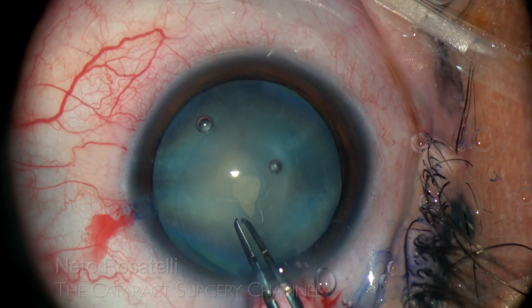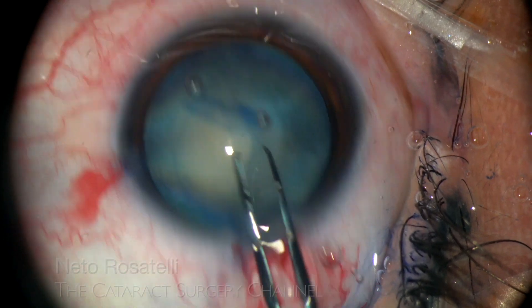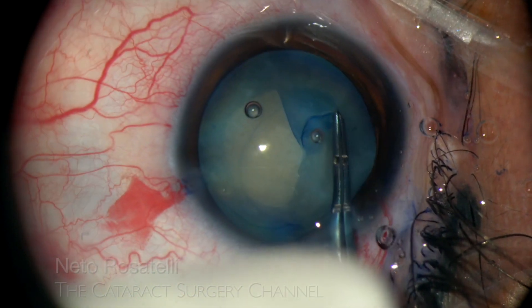As the initially created flap favors a clockwise rhexis, that's the direction I go with the help of an engraved Inamura forceps.